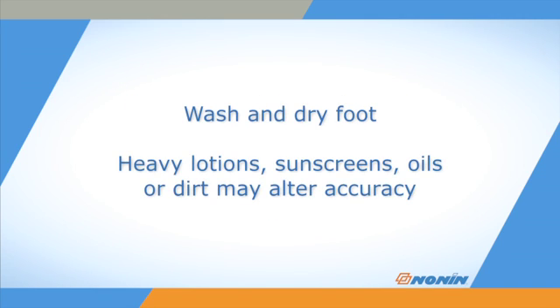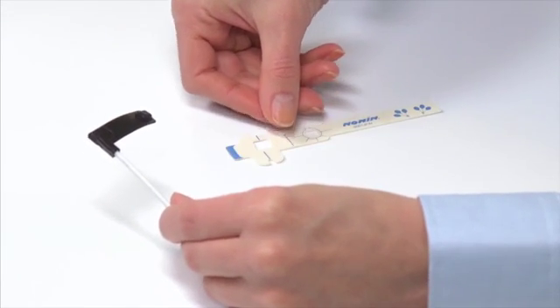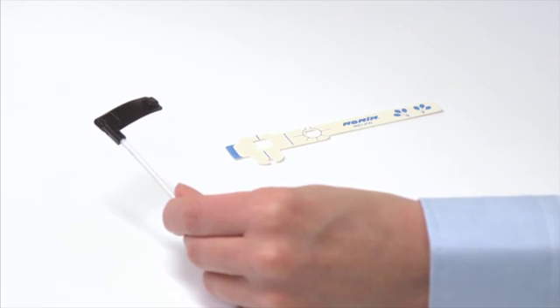Wash and dry the foot where the sensor will be placed. Heavy lotions, sunscreens, oils, and dirt may alter the accuracy of the sensor, so start with a clean, dry toe or foot. Place the Flex sensor and a new FlexiWrap on a clean work surface.